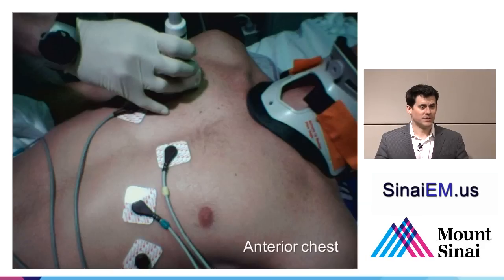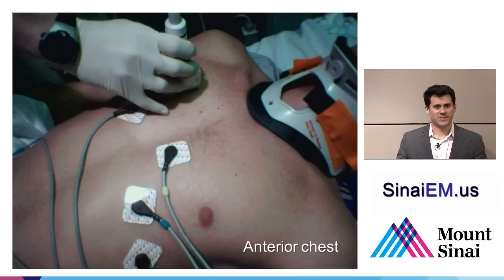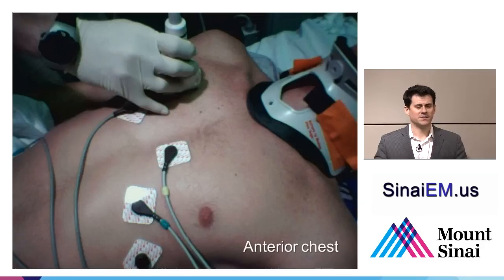If a patient has really abnormal anatomy, if they've had prior VATS procedures, if they've had pleurodesis, if they've had blebs and multiple pneumothoraces in the past or surgical procedures, then it's much more difficult to confidently rule out pneumothorax everywhere. You could basically look at each individual aspect of the chest and say that there's no pneumothorax at that spot, but the lung sliding, due to adhesions and other factors, is going to be a little more difficult.